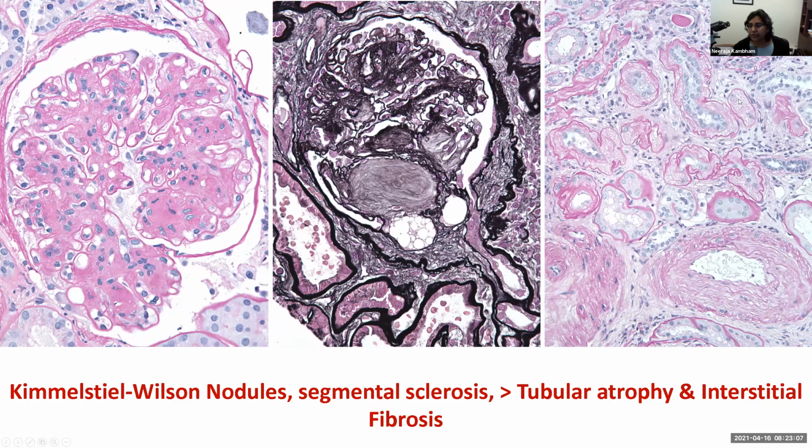So there's a lot of tubular atrophy and fibrosis with all these blue dots in between, interstitial inflammation associated with that. And at the bottom of the screen is an artery, and you can see that the lumen of the artery is narrowed by this intimal sclerosis that is happening. So all of these changes are affecting multiple compartments of the kidney parenchyma.